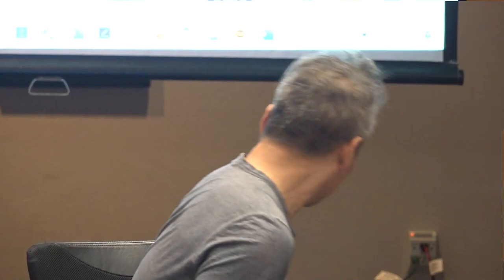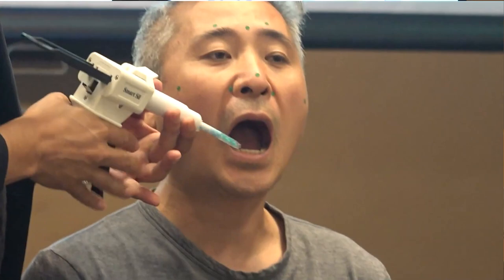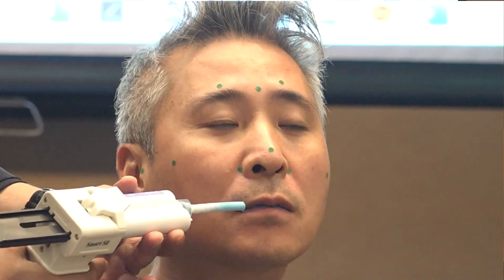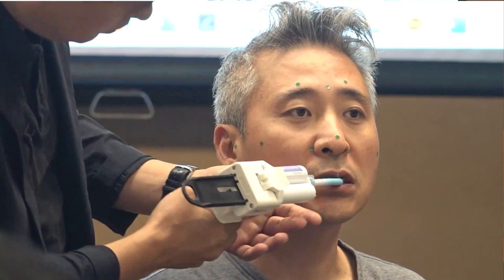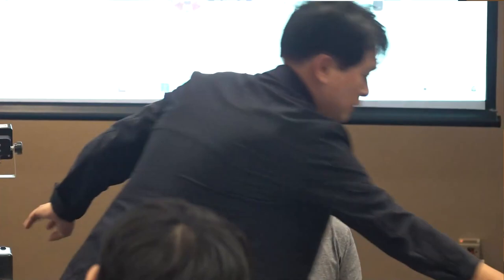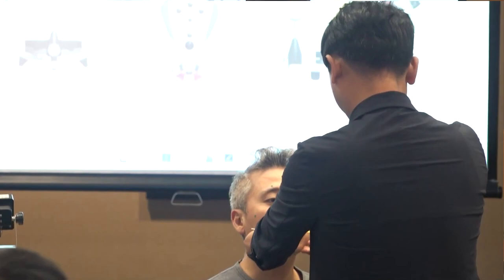Okay, let's imagine this patient has the anterior teeth, or this patient is wearing the occlusal rim now. So, open. Bite. If we use the digital method, you don't cover the anterior teeth of the upper teeth. So the lower portion is positioned like this. After positioning, you have to check the balance between the left and right side.